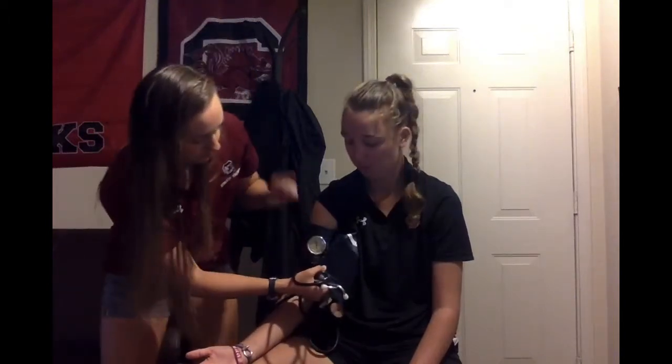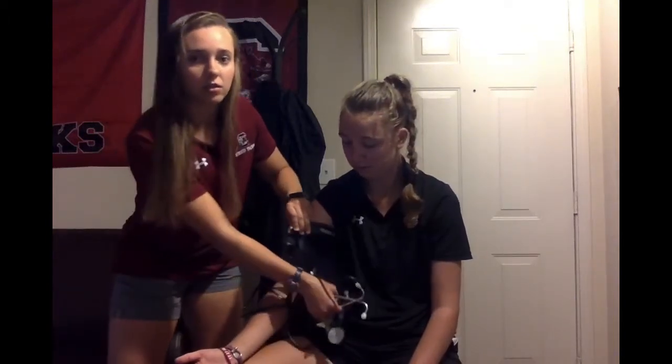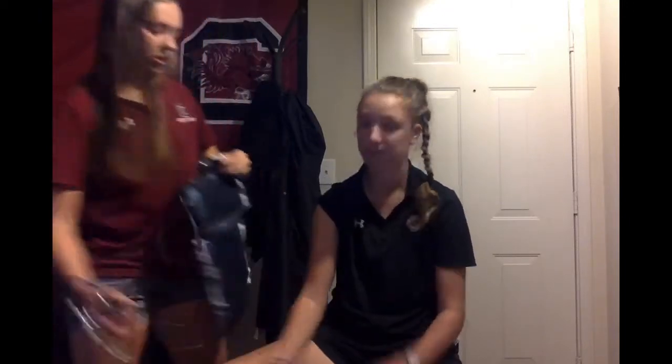Make sure to not go off of the bounces that are shown on the actual blood pressure gauge. The initial blood pressure reading is under 120 over 80 millimeters of mercury. Anything above this is considered elevated. Thank you.